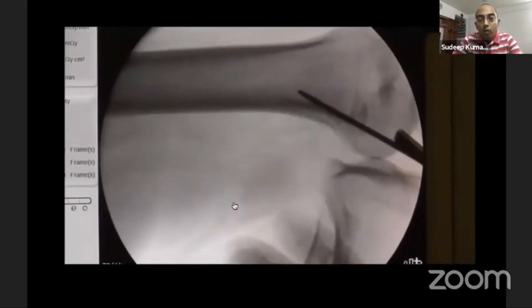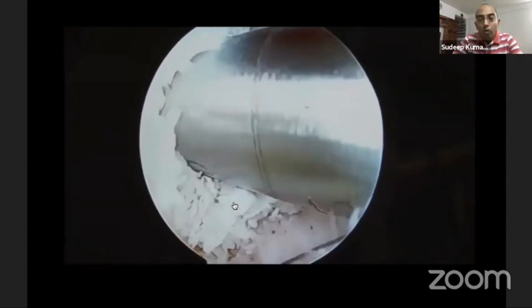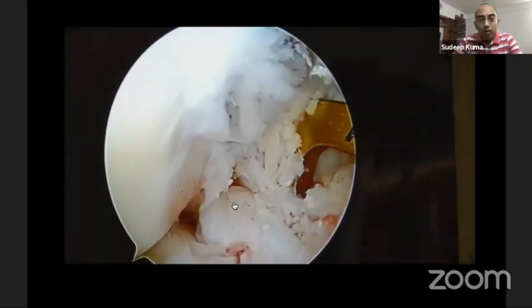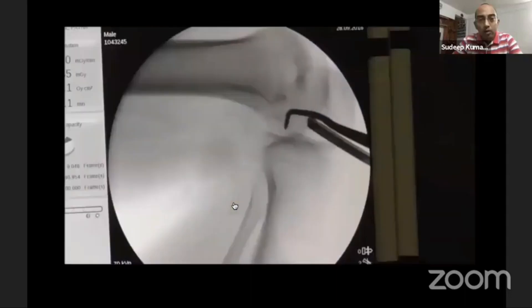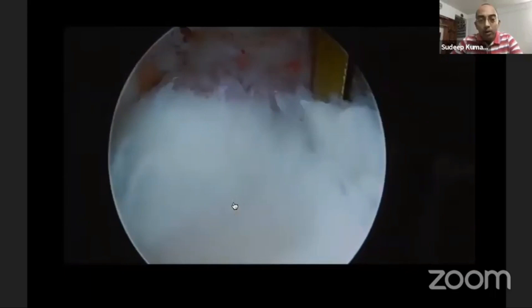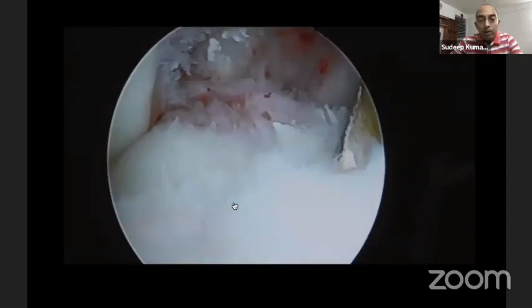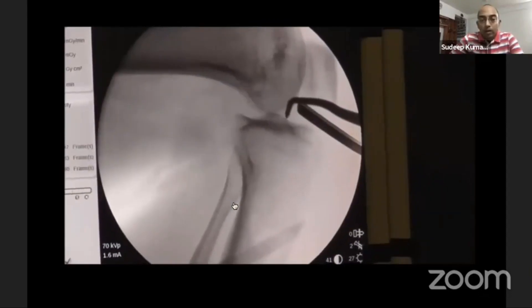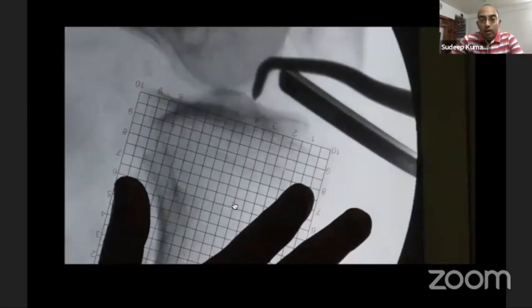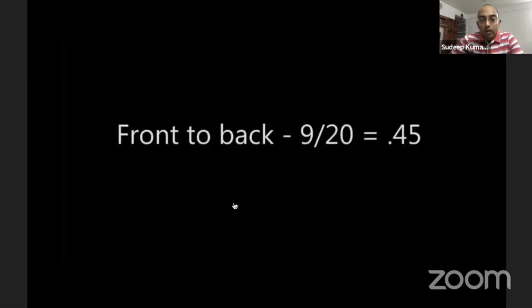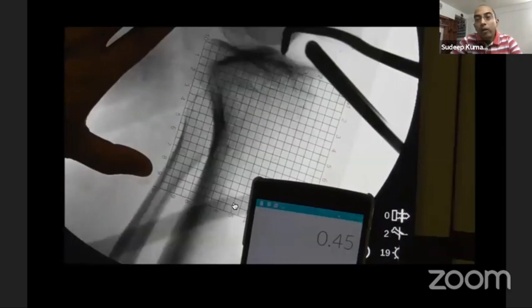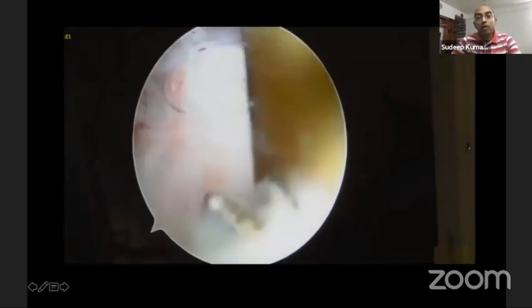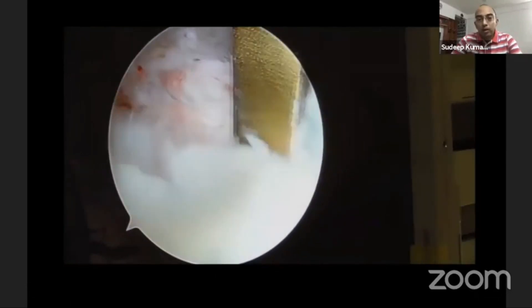Then I can drill further — using an endobutton or tightrope, deciding on the length to drill. Similarly for the tibial tunnel, you can easily preserve the remnants. You put the guide wire, take a shot, and place the grid on the C-arm image. It shows 9 out of 20 boxes, which is 45% from front to back — ideally where the center of my tibial tunnel should be — without disturbing any remnant.